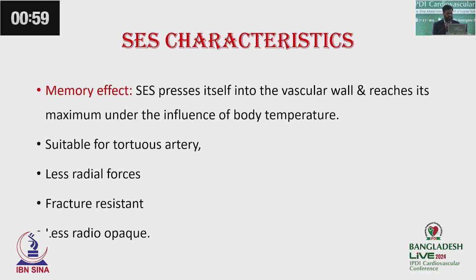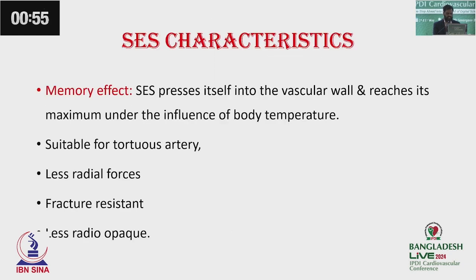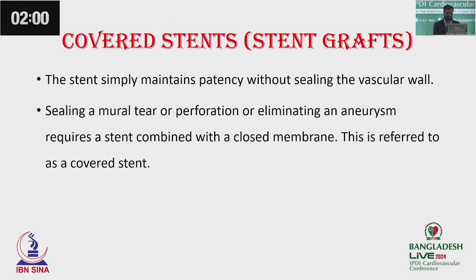And there are some other characteristics: it is suitable for tortuous artery, and it is also fracture resistant. These are some pros and cons regarding different stents.